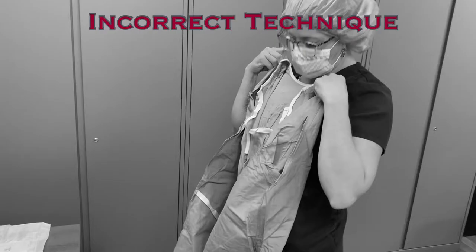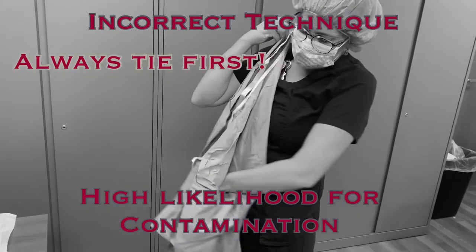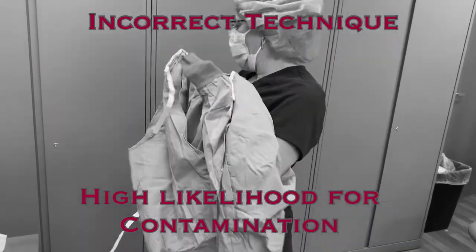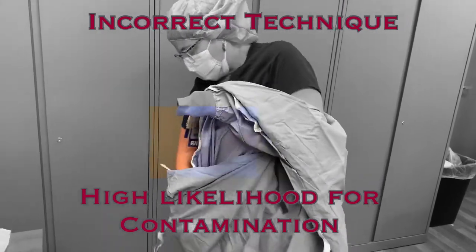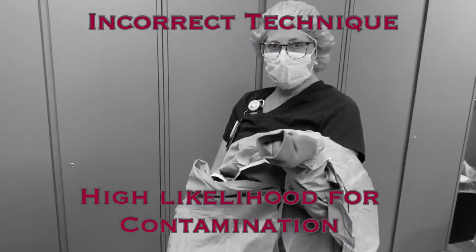There are many common issues with this stage of donning that will lead to contamination. Inserting your arms into the sleeves before tying the gown behind your neck will lead to a lot of additional movement to try to shrug the gown onto your shoulders, and it is likely that this will lead to contamination of the gown. Additionally, with your arms in the sterile gown, you will not be able to tie the gown behind your neck without assistance.